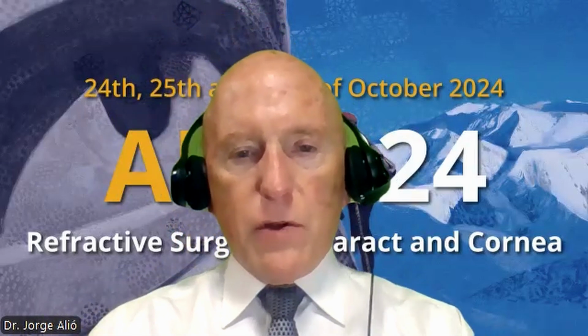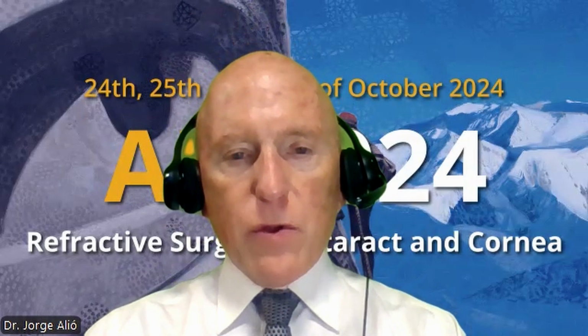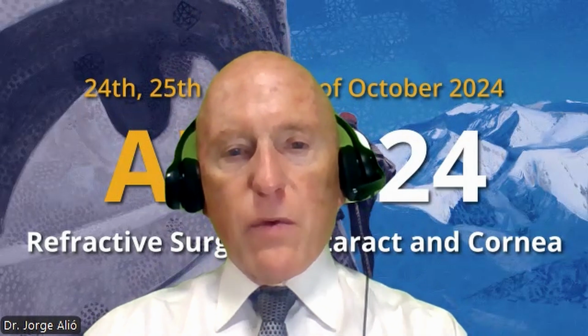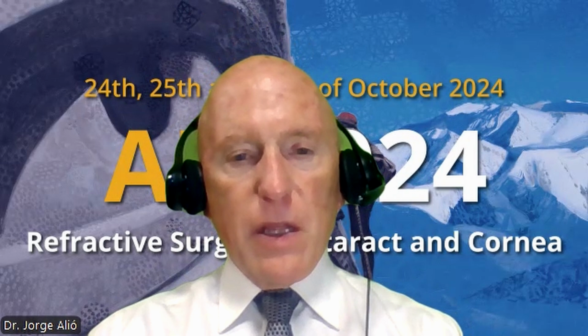Andrea Russo will introduce to you how to solve a problem in which he had a tear in the LASIK flap in a hyperopic LASIK. You will learn how to calculate the depth of the new interface created with the femtosecond laser, and how to deal with this complication, which ended in a happy ending in this very case. I'm sure that all of you refractive surgeons will learn how to deal with these cases in a particularly successful way.